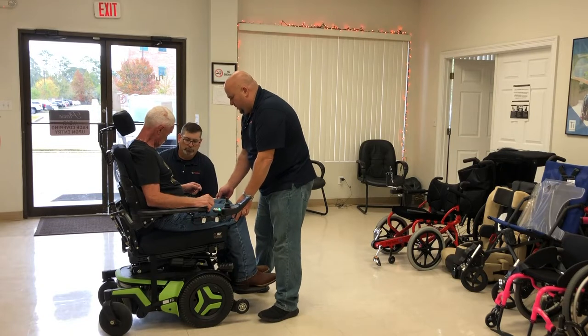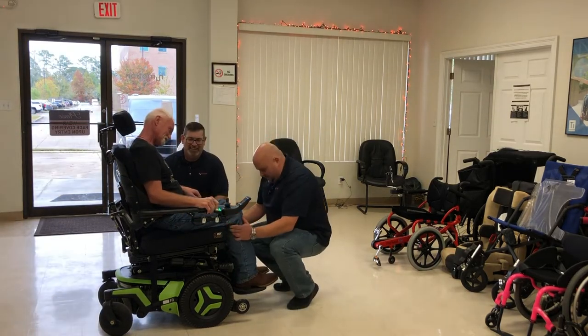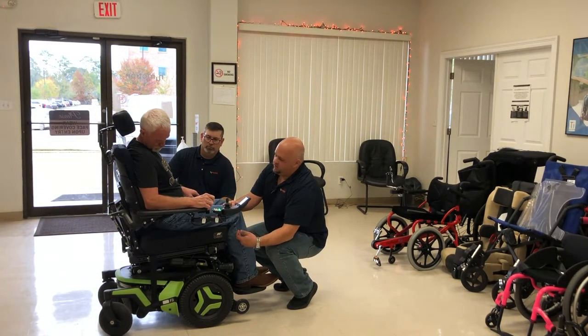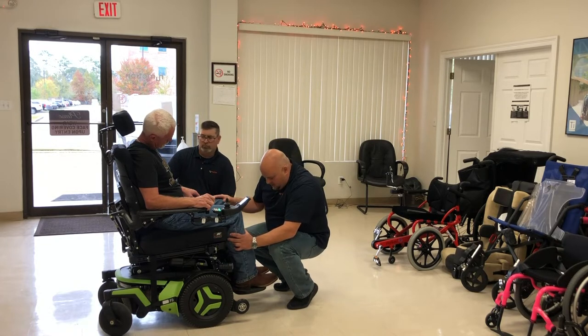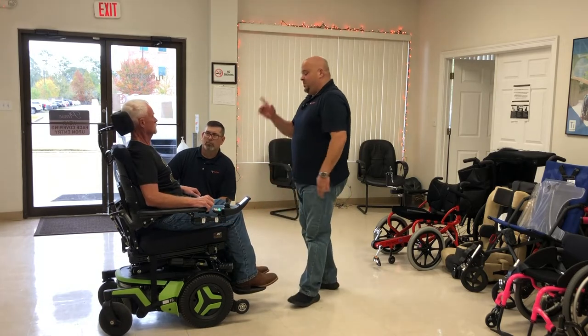Let's check your hips — I'm going to scoot your butt over just a little. There we go. The seat depth looks great even with the boots. Are you wearing your boots mostly every day? We want to make sure your legs are at 90 degrees right here. You don't want too much downward or upward pressure. It's adjustable up and down, so we can accommodate this angle. Your hips look good — you look neutral in there.